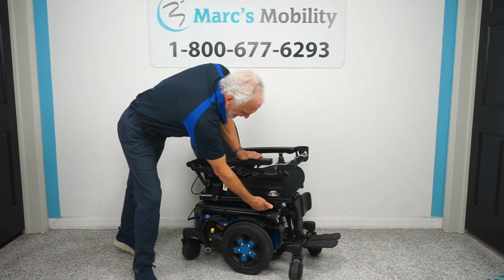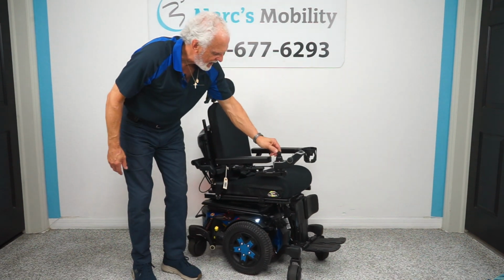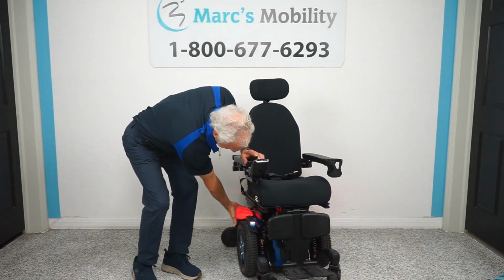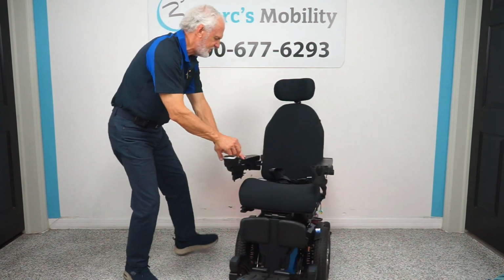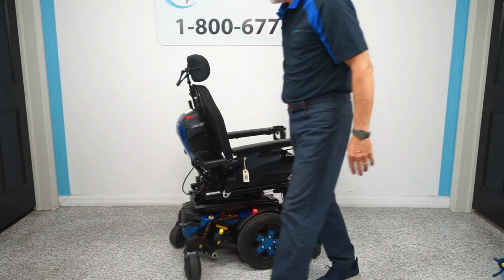The chair has a button right here, right with my finger. If I tap it, now we have headlights and tail lights. You can see the tail lights on the fenders. So you have headlights and tail lights.